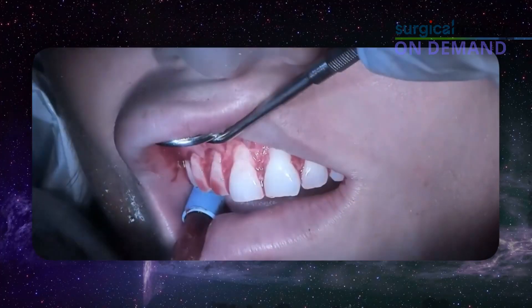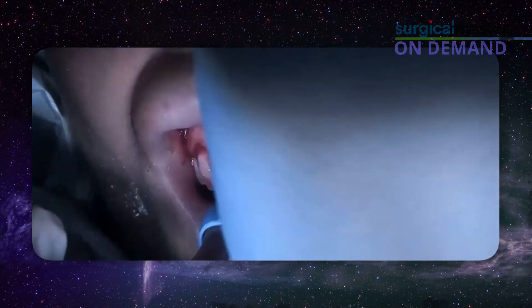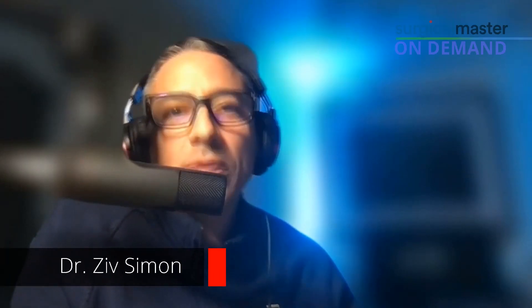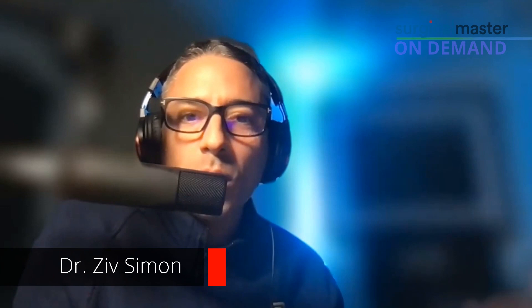There's a little tear there on number nine. Dilemma, right? What do you do? So first of all, you stay calm. Nobody's dying today — we're going to be fine. What's the worst case scenario? Patient will have irregular gum tissue, or we have a little bit of recession. We can always graft it.